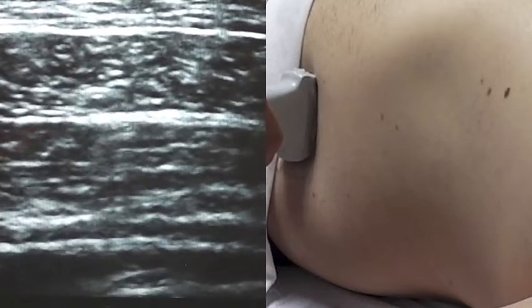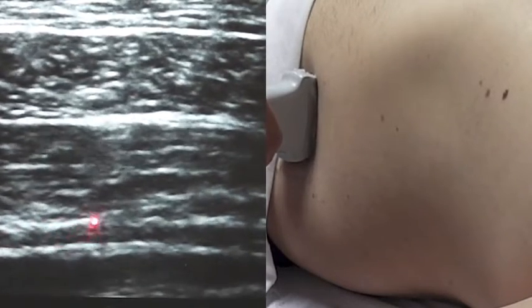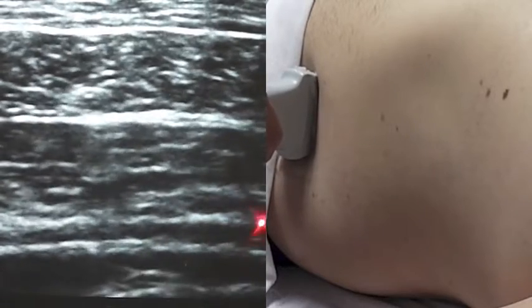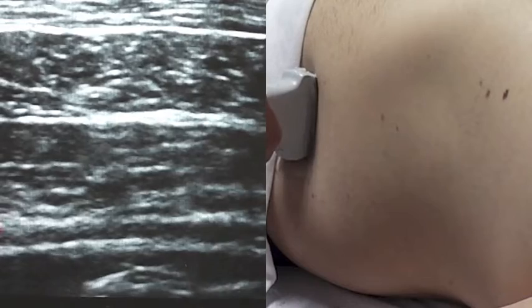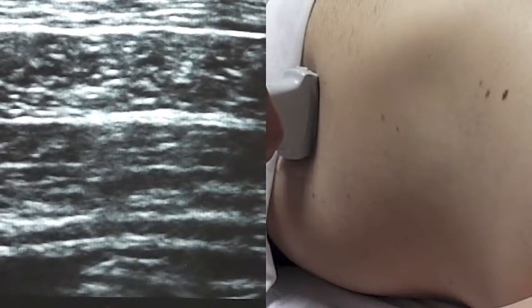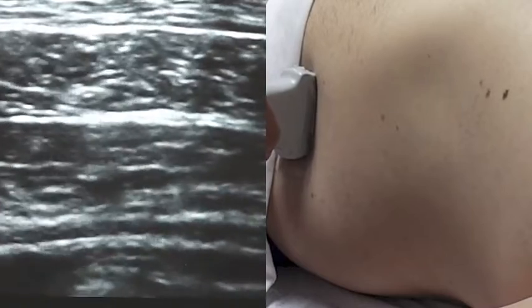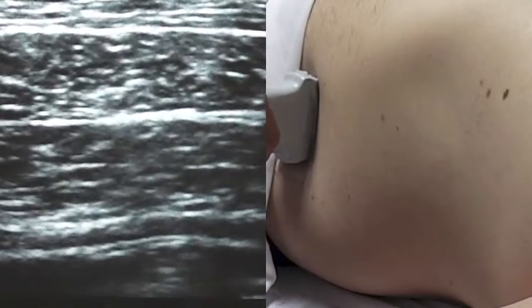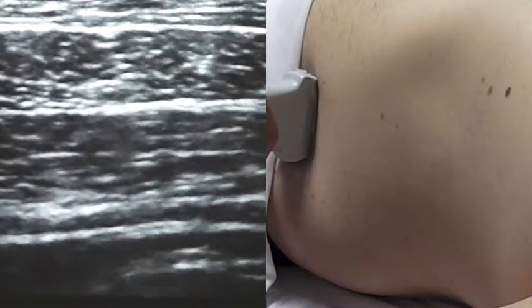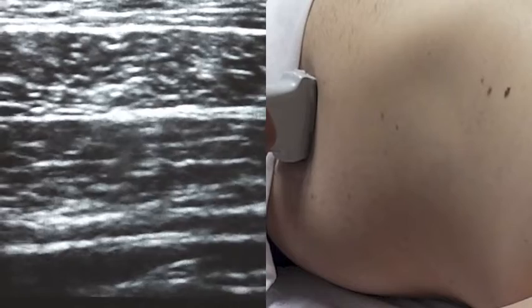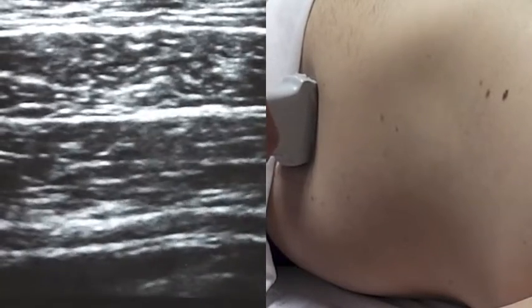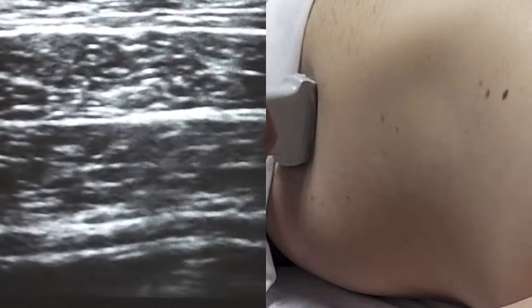Our target is just deep to the internal oblique, above the belly of the transversus abdominis. The goal here is to split the fascia off of the muscle because the terminal roots of T7 through L1 lay on the belly of the transversus abdominis muscle. This is a large volume block requiring 20 to 30 cc's of local anesthetic per side. At Stanford Hospital, we currently use 20 cc's of quarter percent Marcaine per side if we're doing a bilateral procedure, and 25 cc's of quarter percent Marcaine per side for a unilateral block.